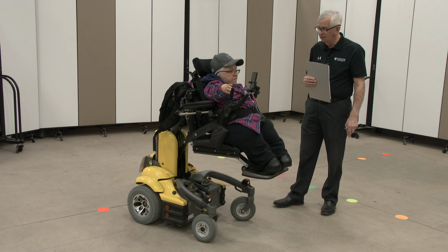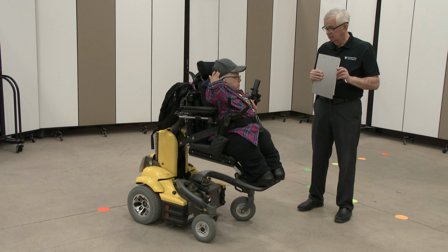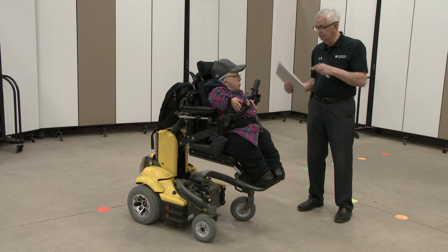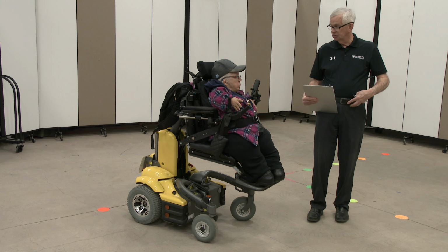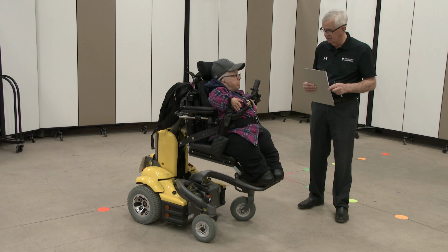And you have a recline function as well? Pardon me? Recline. That's what I just showed, the tilt. Not where the backrest goes back but your legs stay where they are. No. Okay, so the tilt and the elevation are the two.